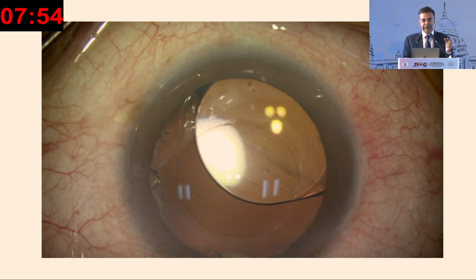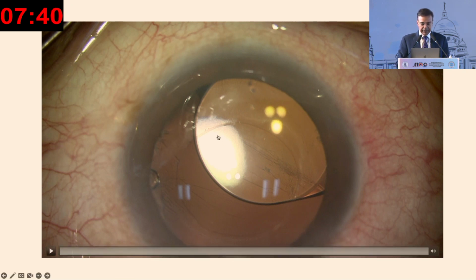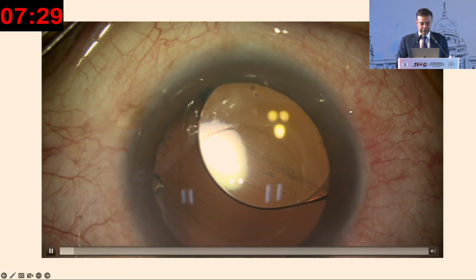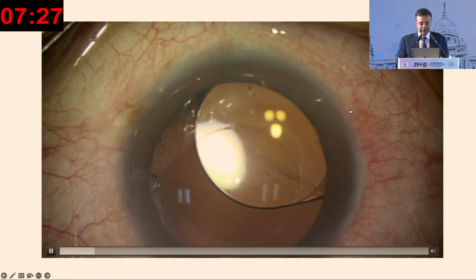So the trick is to make a small central capsulotomy. That's all that is required. If you do a big capsulotomy, the lens can in such situations move about, especially some of the hydrophilic lenses, which are more prone to do that, but this was a hydrophobic acrylic. So we had a big PC break, almost as big as that, and through that the IOL had gone behind the bag, and I thought I would again have to do something similar to the previous case.